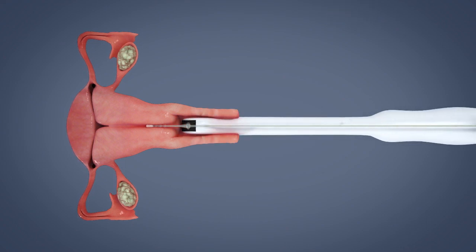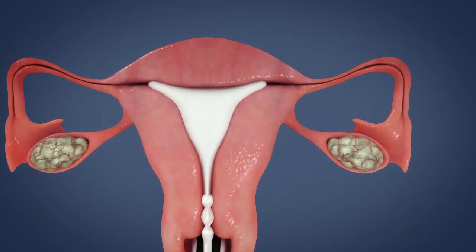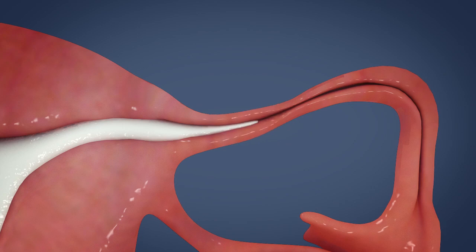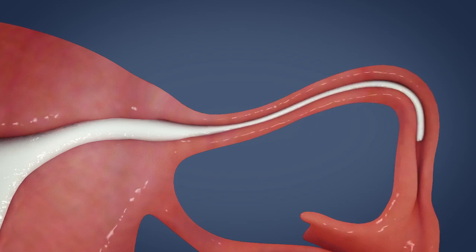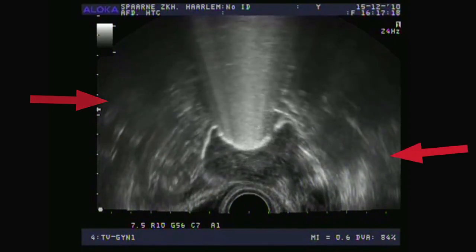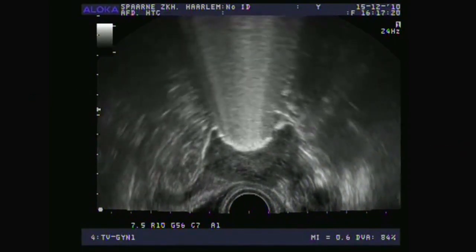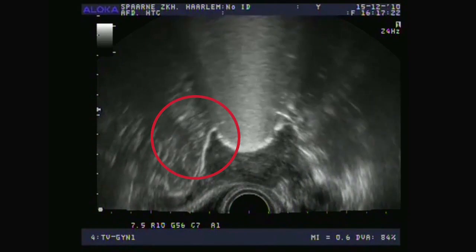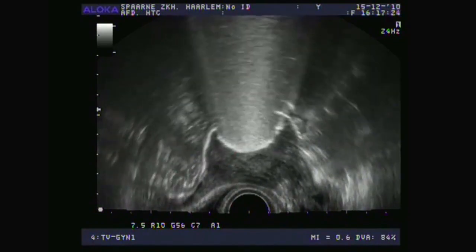The gel foam opens the tube from its natural collapse state and flows unless there is an obstruction. The ability to infuse the foam is an indicator of patency. Patency can then be confirmed using ultrasound imaging to detect the presence of the foam running the length of the tube.